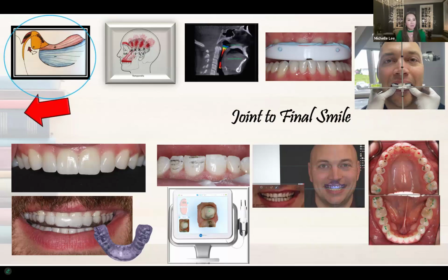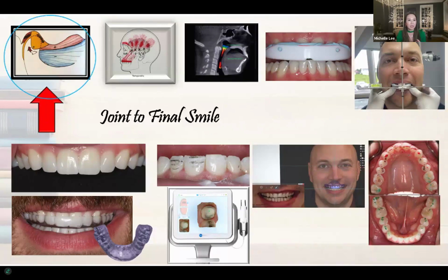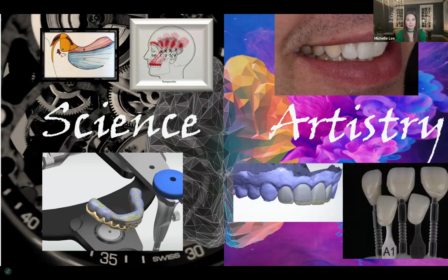So that is the overall flow, and my passion in dentistry is always to start from healthy jaw joints, and we took that to understanding muscles. We now know where splint therapy, specifically from tonight's talk, where anterior-only appliances fit in. We can utilize that to take records. We can create stable occlusion. We then go into the design process, the fun part where we're designing smiles, doing the dentistry, and delivering the case. And now we're circling all the way back and saying, okay, now that everything is delivered, what do I need to do to protect the dentistry? So we finish with another appliance. I really strongly believe in this type of process.